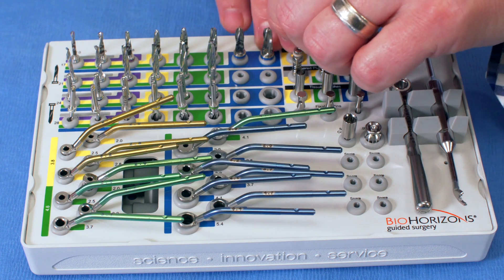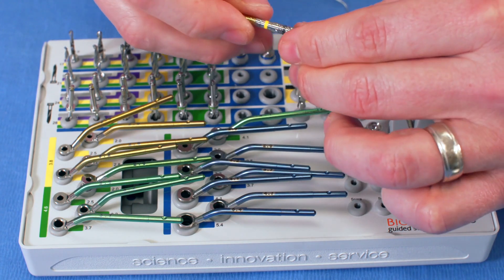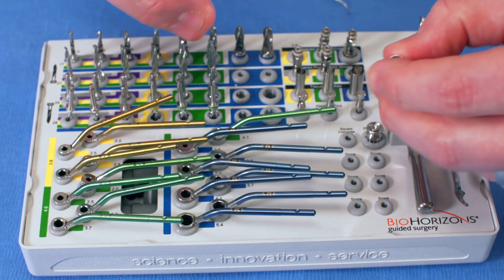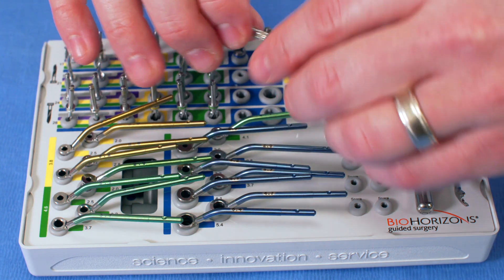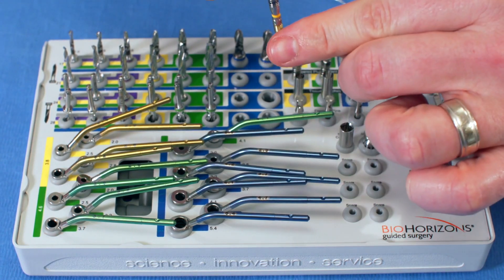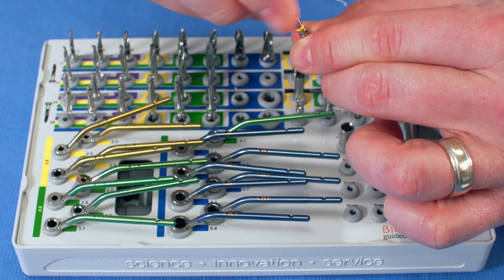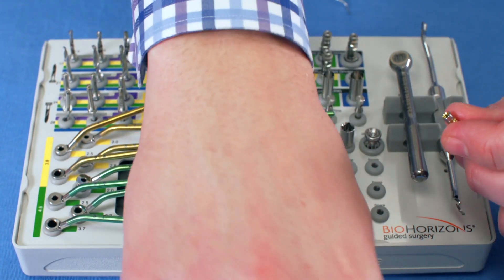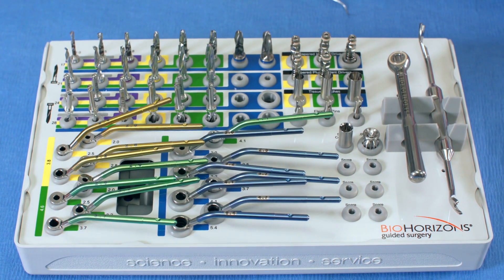When ready to place the implant, you use a tapered implant driver that picks up the implant just like a normal driver — except it screws in. You screw it into the implant and carry it into the mouth, using a square converter to drive it with the implant motor, then ratchet it into place with a surgical ratchet through the guide. Once the implant is through the guide and in place, you take the ratchet off, unscrew the implant driver through the surgical guide, and the implant is in the bone.